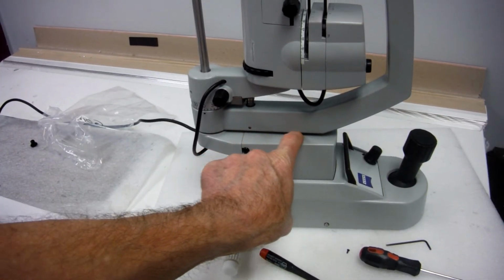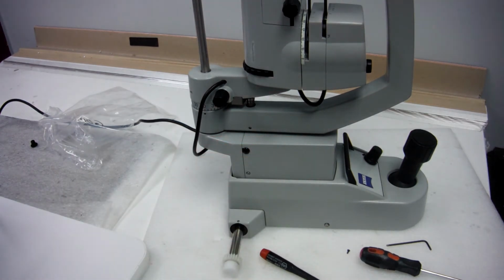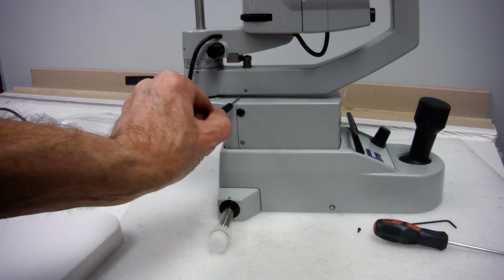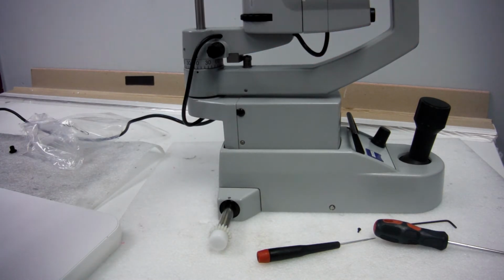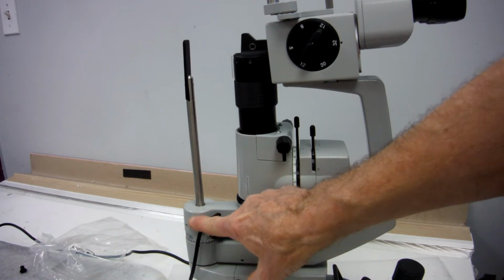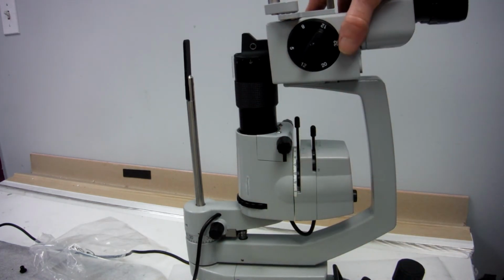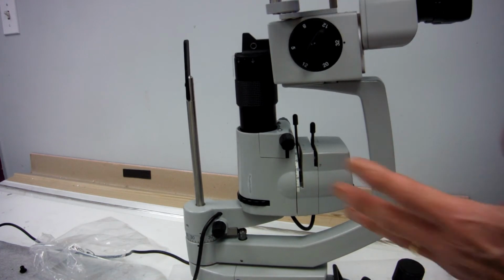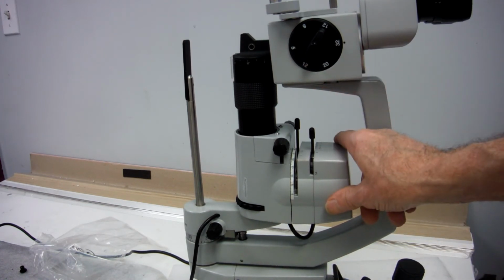It's looking at the space under here. It should be even all the way across. On this one, it's not. There's a lot more space right here than here. So evidently this arm has been bent. When we moved it back, it could not get into focus because something is bent in here. This post, this shaft in here is bent and caused this space to be too close, and so we can't focus. So that's an issue. If you can't focus it, it's very possible that something is bent.